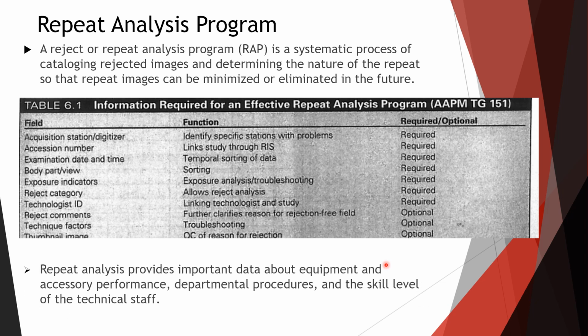And this would be in the collecting data process, okay. Repeat analysis provides important data about equipment and accessory performance, departmental procedures, and the skill level of the technical staff, okay, as we talked about. So it could be a departmental procedure that's causing films to be repeated.